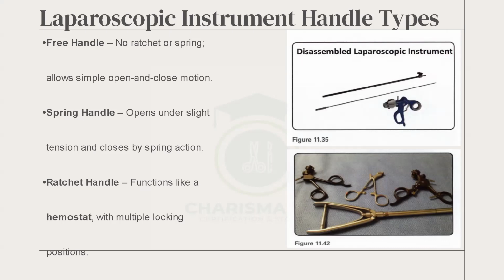On the top one, the dot is a port. It's a hole, a channel. They close it so that blood does not come out through it. What it means is that if it is used, there will be blood stuck in that tube. You need to flush it, and with running water, you need to sonicate it so that cavitation will create bubbles that implode and clean your tubings.